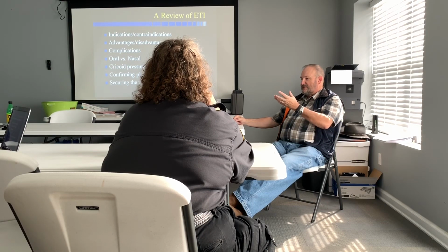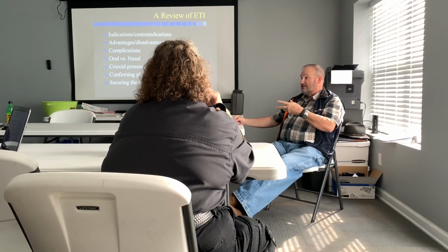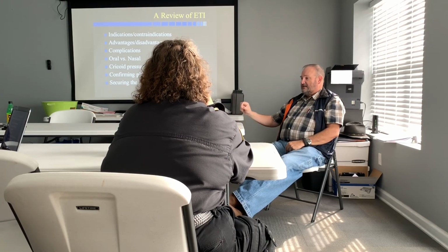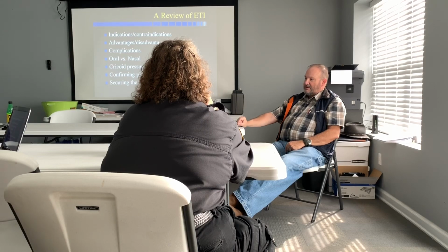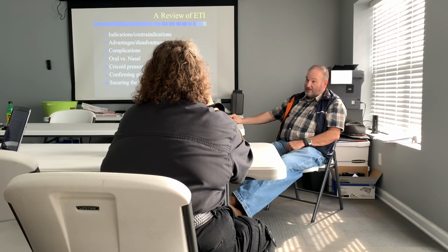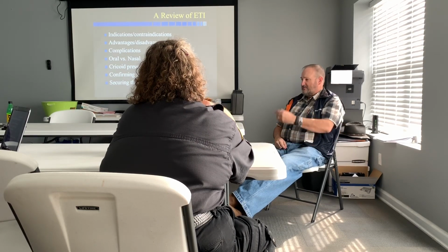Remember, end-tidal CO2 and PCO2 are very, very closely related. Usually no more than about 3 millimeters of mercury off, but a lot of times it's 1-to-1. And when I can look at his end-tidal CO2 and get a good idea of his acid-base balance, and therefore get an idea on why he's doing what he's doing or why he's not doing what I want him to do, it's just an awesome tool. It's probably one of the best tools I've seen come around.